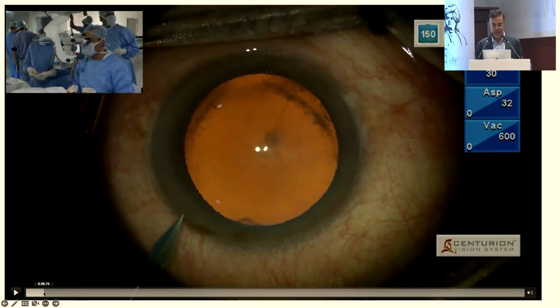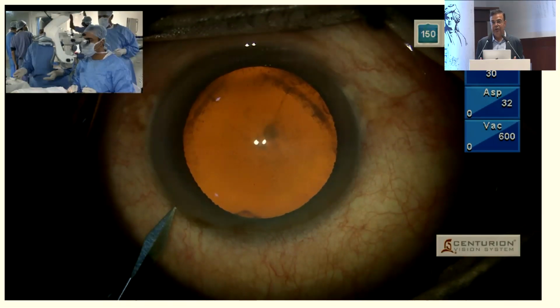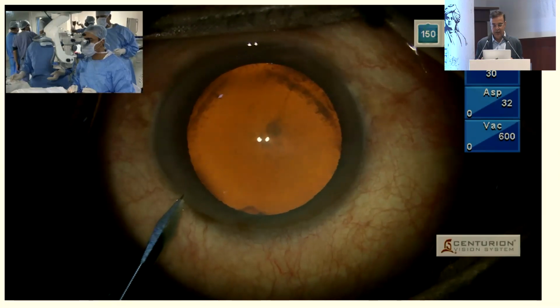Now, I went in with an MVR. Now, I like to use an angled MVR, and I forgot to carry my own knives there. An angled MVR, that too has to have a very short bent part. The bent part should be really, really short. And it should be angled at the right, 30 degrees or whatever, so that it doesn't point towards the lens. And I got a blade which was not very sharp. It was a straight MVR. And I hate straight MVRs because they are prone to cause problems if the patient has a strong Bell's or something. So just see what happens.